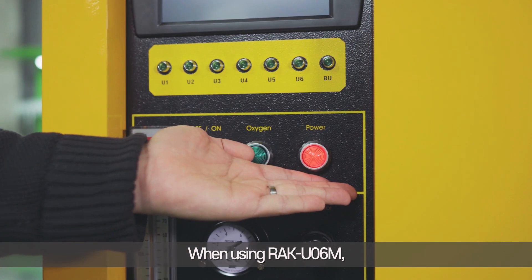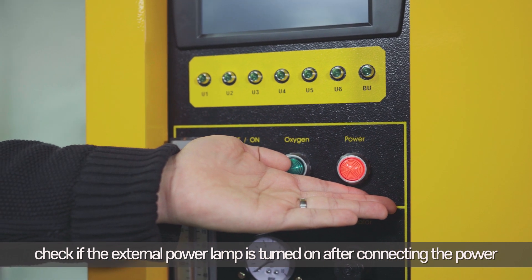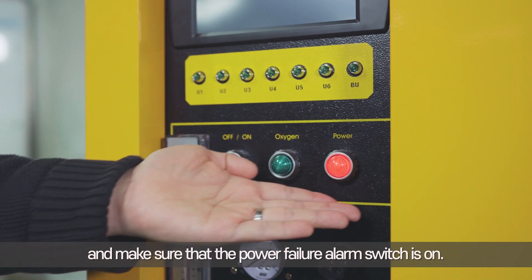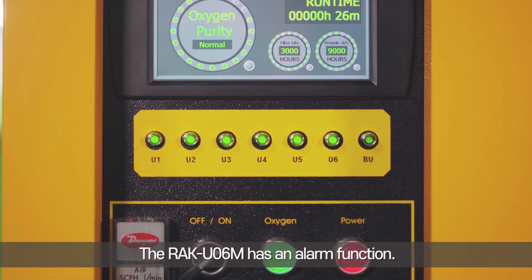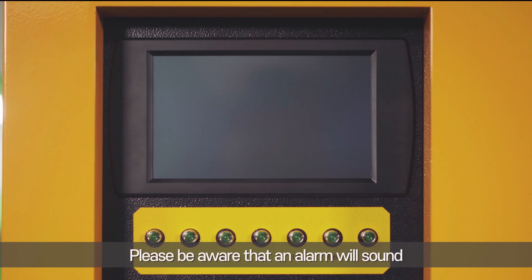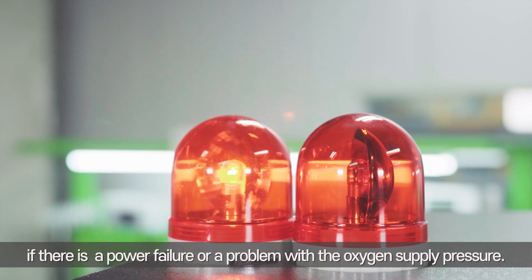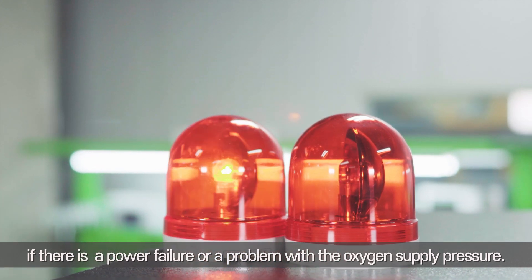When using the RAK UO6M, check if the external power lamp is turned on after connecting the power, and make sure that the power failure alarm switch is on. The RAK UO6M has an alarm function — an alarm will sound if there is a power failure or a problem with the oxygen supply pressure.